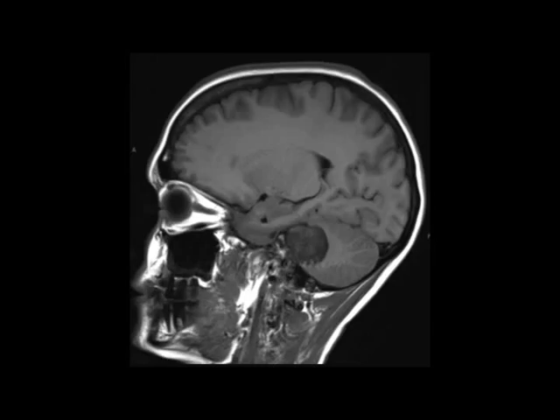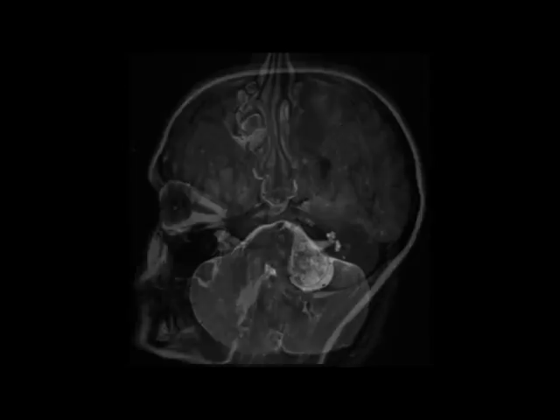This is a case of a vestibular schwannoma in a 28-year-old female with left-sided tinnitus and hearing loss. The lesion, which arises within the internal auditory canal on the left, demonstrates heterogeneously hypo-intense signal on the sagittal T1-weighted sequence.